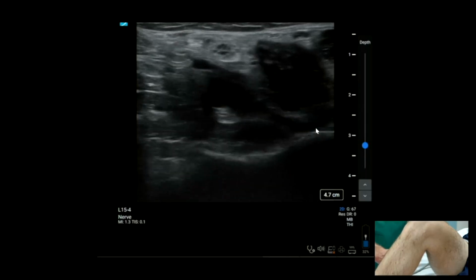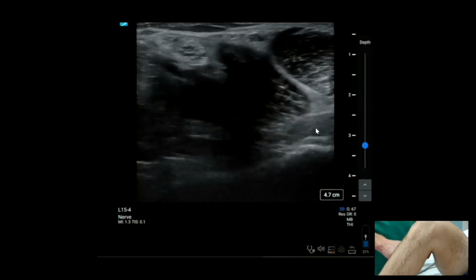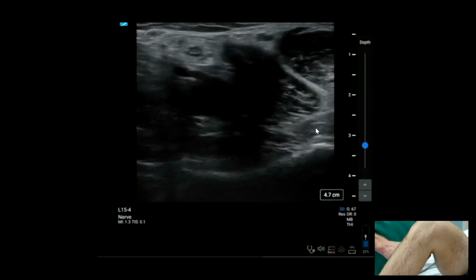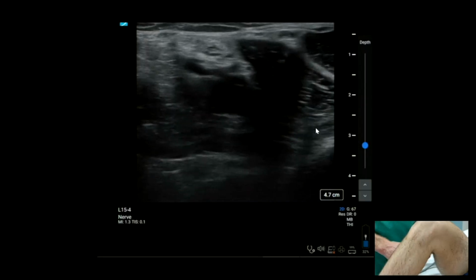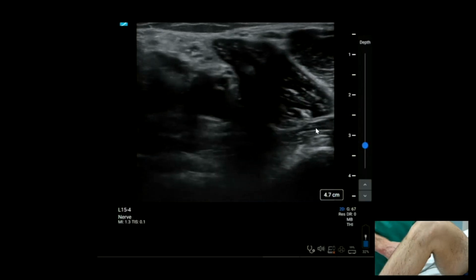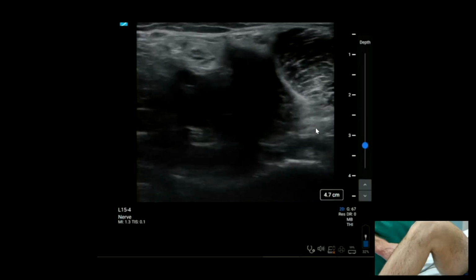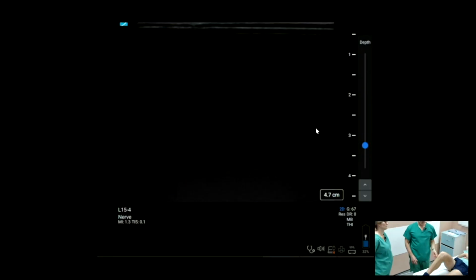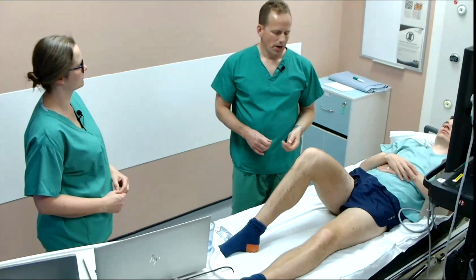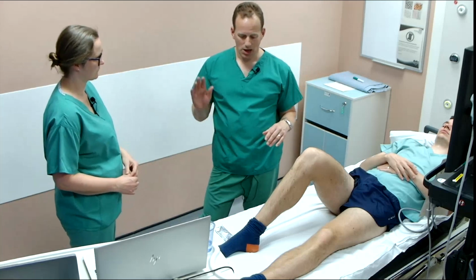So we would approach from the lateral aspect, and doing that, you've got to be really careful, having seen that common peroneal nerve, you want to avoid it, and then you're aiming to get into the sheath around the tibial component and putting in maybe just 8 mils of local anaesthetic maximum. Just enough to get a block of that nerve, but not so much that you're going to get spread to the common peroneal. And this has been shown to provide effective analgesia, equivalent to that of a sciatic nerve block. But what it should do, if done properly, will not give you a foot drop.